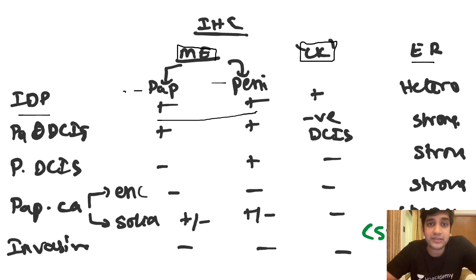When I look at the cytokeratin, CK5/6 will be positive and ER will be heterogeneous. When I say heterogeneous, it is undoubtedly your usual ductal hyperplasia type and is benign proliferation, that's all. If you have in your papillary lesion apocrine metaplasia, in apocrine metaplasia ER will be negative, and I want you to know that, fine. Please keep in mind ER will be negative in an apocrine metaplasia, got it?